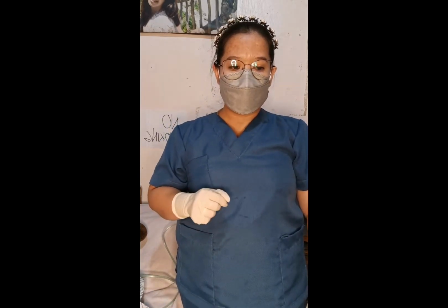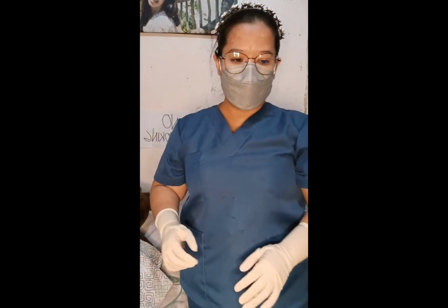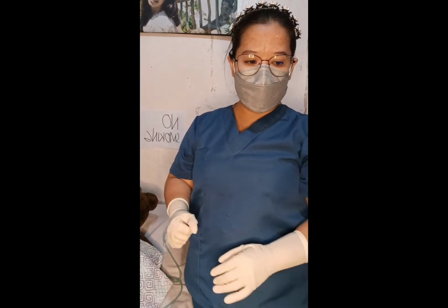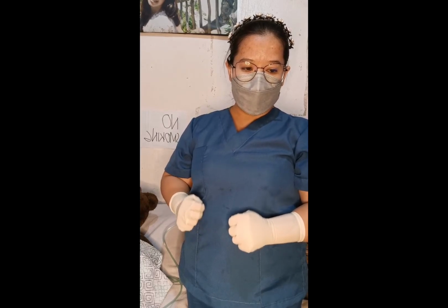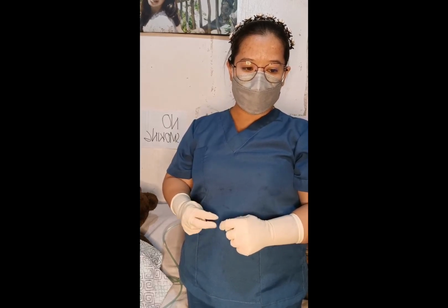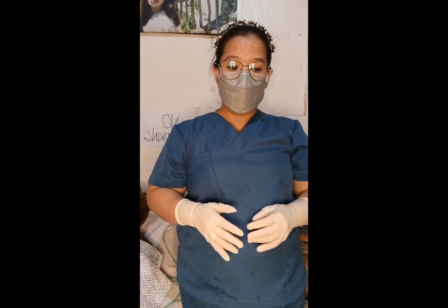We need to assist our client to semi or high Fowler position if tolerated. This position facilitates optimal lung expansion. So we will help our client, and then we will insert the flow meter into the wall. Oxygen in high concentration can be drying to the mucosa.